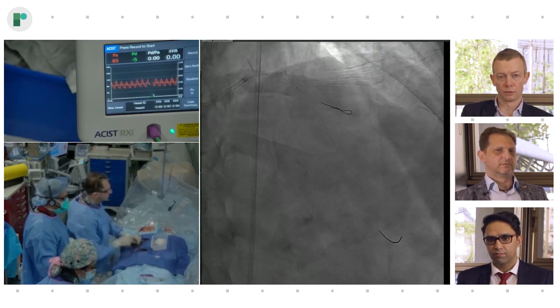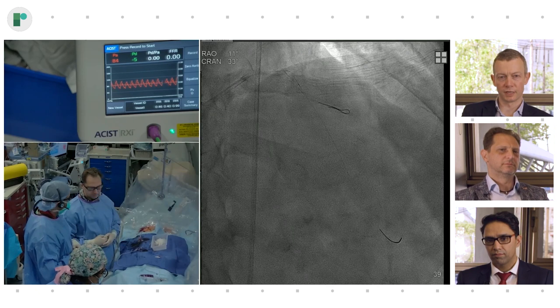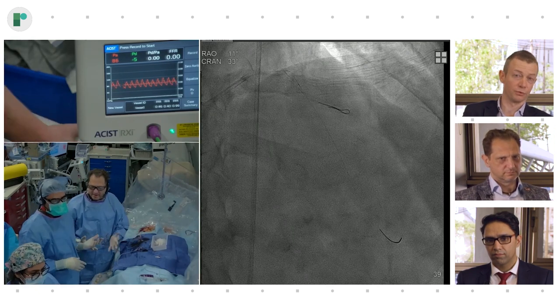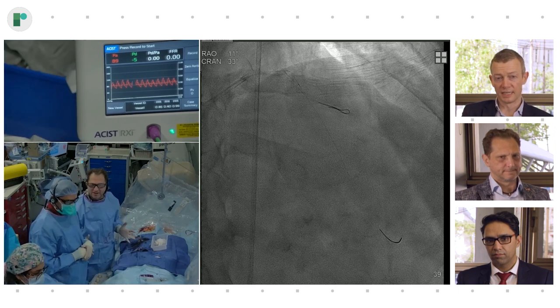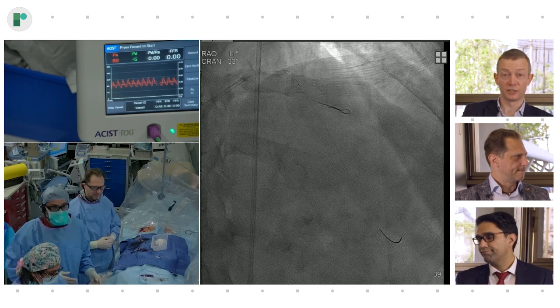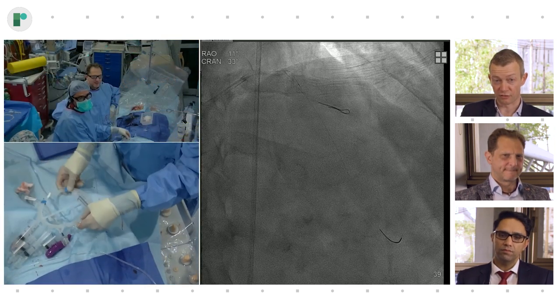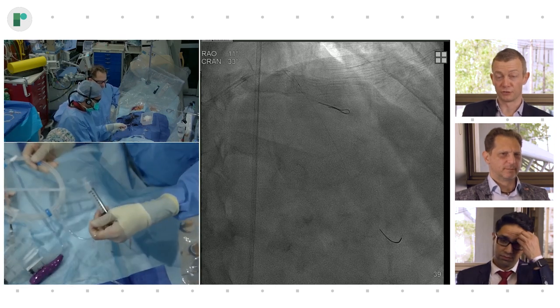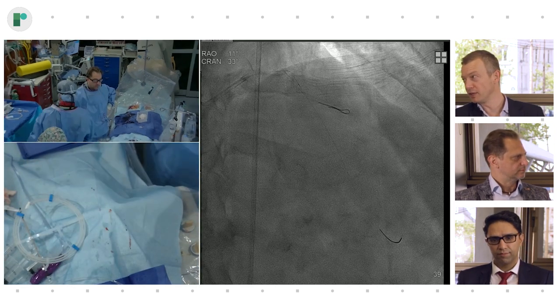Yeah, so the Kodama IVUS is quite an interesting IVUS catheter. It's a high-resolution imaging system which can image up to 60 megahertz. And the key feature is that it has a pullback speed that can go up to 10 millimeters per second. So recall, most of the systems conventionally have this 0.5 millimeter per second pullback speed, which will give you 60 frames per millimeter. But when do you actually need that?